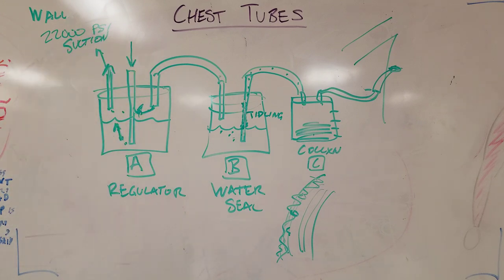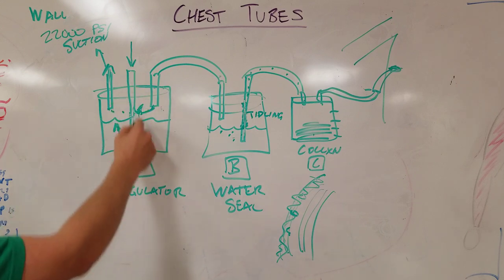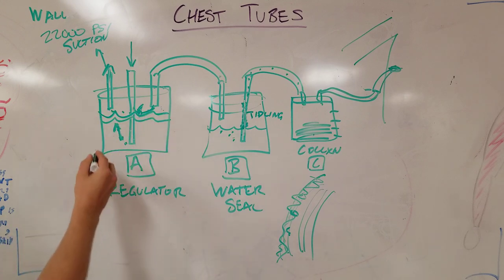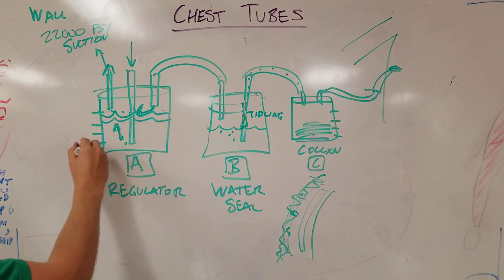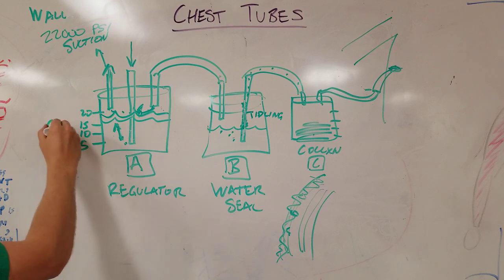Now, how do you determine what the regulator is? At what level do we want that pop-off to happen, where we stop sucking on the lung so much and start sucking on the ambient air? That is determined by your level of water. And that's why this level of water is a little different, and these things have gauges, usually in centimeters of water here.